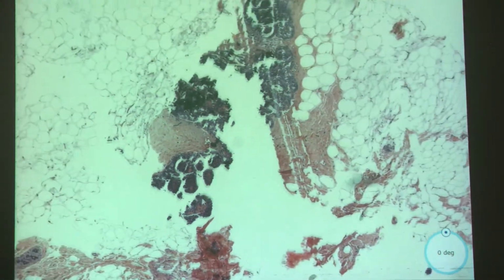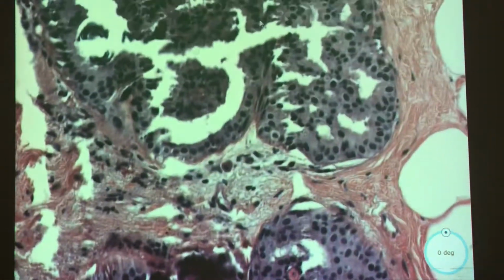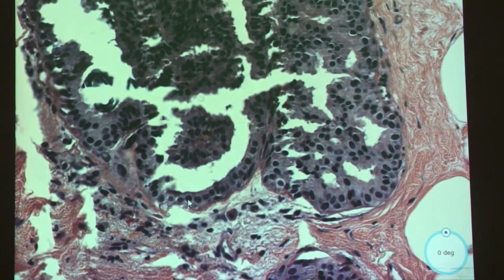Okay. So I feel like we're still dealing with a papilloma. But if we're assuming this is the same lesion, it definitely looks different from the previous one. And they're more similar. It's like peas in a pod, they just all look like their neighbor. So, based off of that, are we in the atypical territory? I think we are treading all over that line.